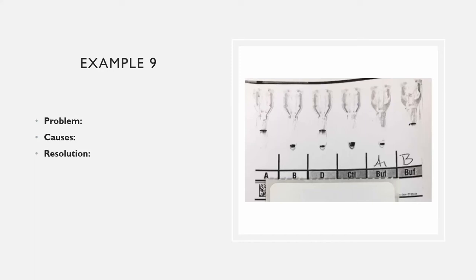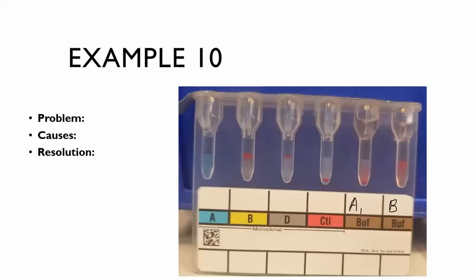So anyway, if you saw a discrepancy like this, you would look at transfusion history. It's likely due to a transfusion. That reaction would be immediate because you have those donor cells floating around. If they're making an antibody to the donor cells, that's not going to be immediate. It's going to take some time for those antibodies to show up on a test, like if they had a transfusion the day before.